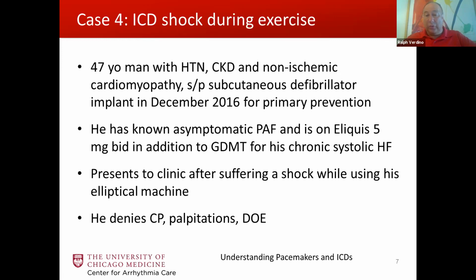So was there anything that you thought was just related to it possibly moving a bit? Yeah, I think this was sort of a make or break situation where at times there was enough of the pin at the set screw level that there were no issues. And then, with manipulation of the pocket, potentially of his arm, there could have been more of that make or break. So that might have represented those spikes in the pacing impedance. Nothing was necessarily done at the time at the outside hospital when they saw those changes. Great, thank you.